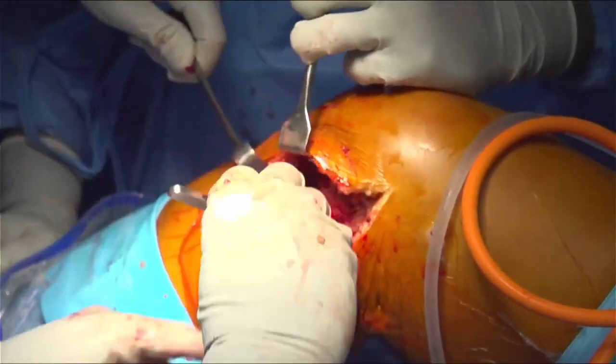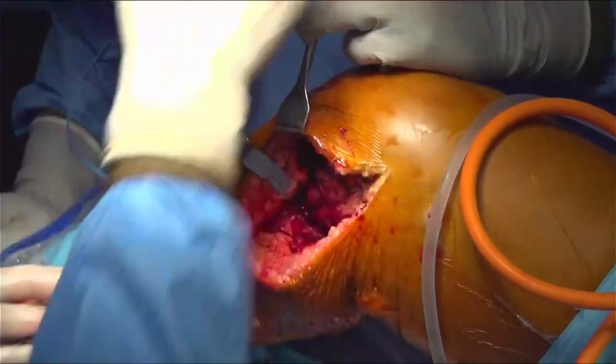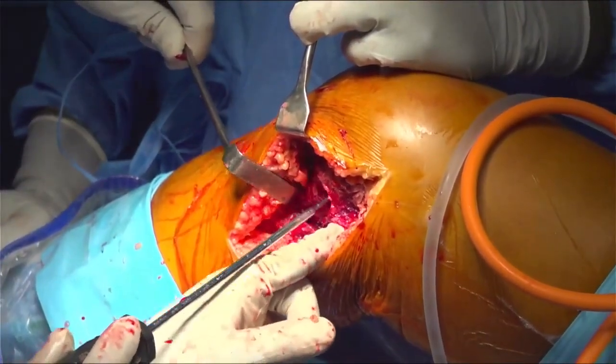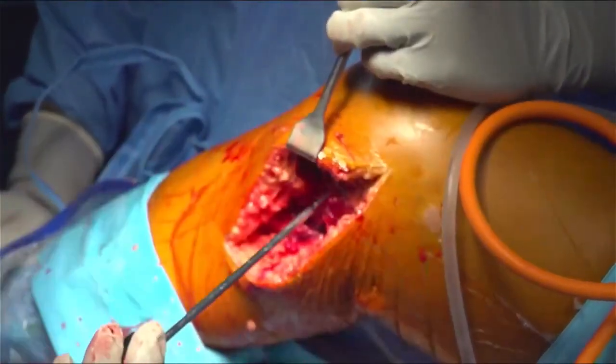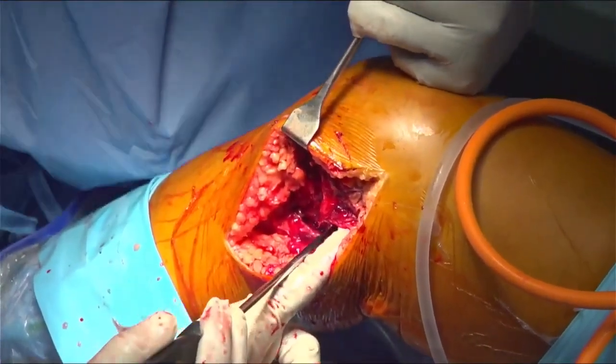So that is okay. Anchor please. Inserter, 5.5 PEEK anchor. Because this is cancellous bone, we can see here, if you can lift it up here. So this is my tibia, which we can see till the back here.